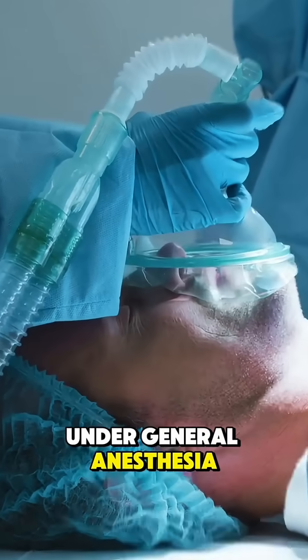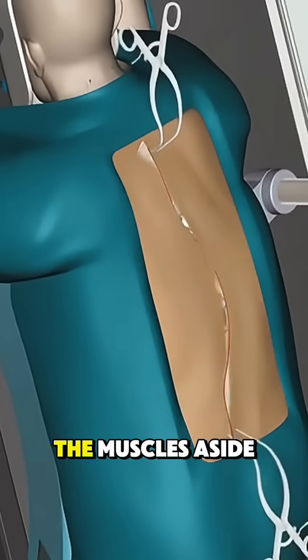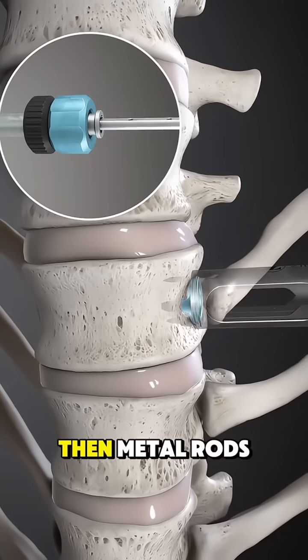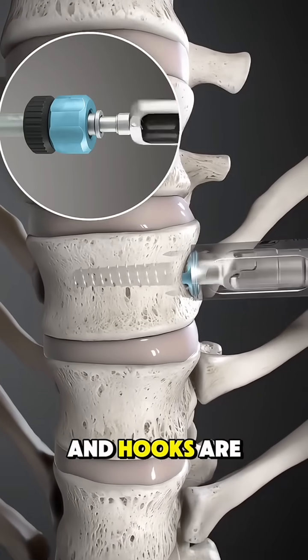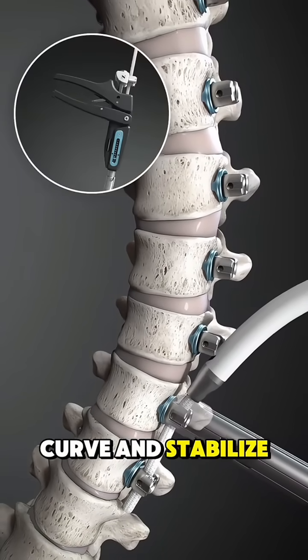Under general anesthesia, the surgeon makes an incision along the back and carefully moves the muscles aside to access the spine. Then, metal rods, screws, and hooks are attached to the vertebrae to correct the curve and stabilize the spine.